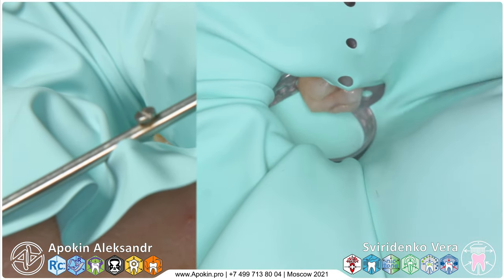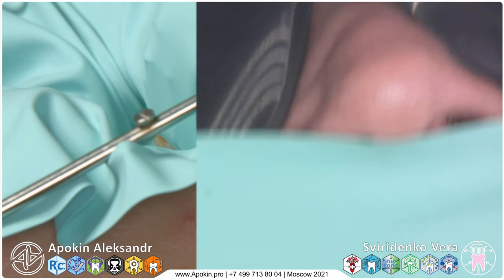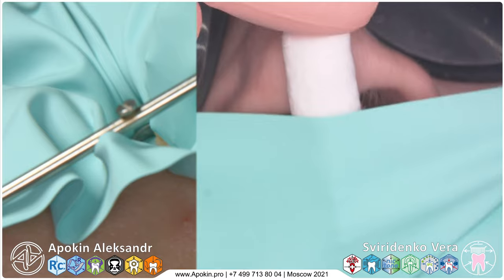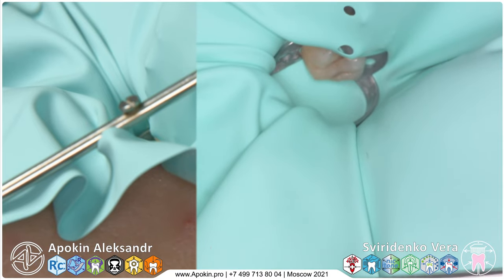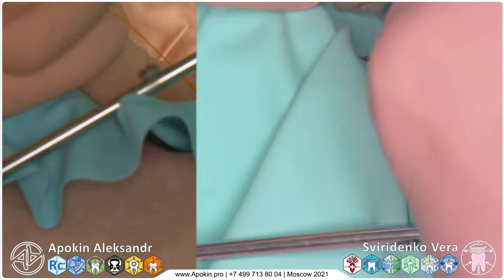Also, very important, be sure that your nose has enough air supply, and make this small trick. Then continue to work using floss to insert the rubber dam between teeth.